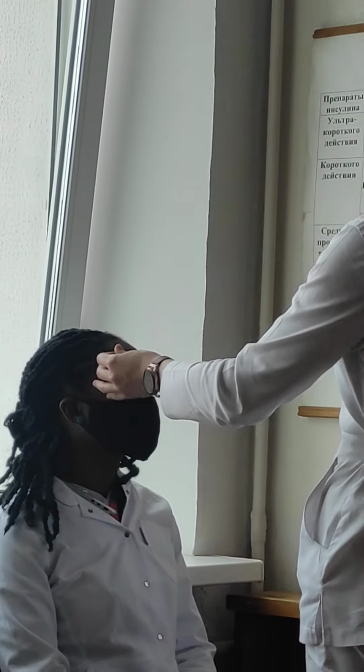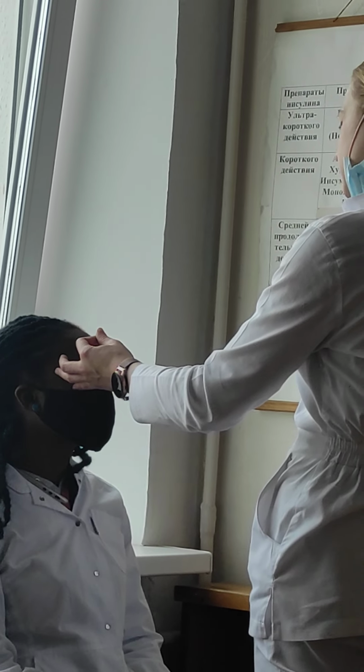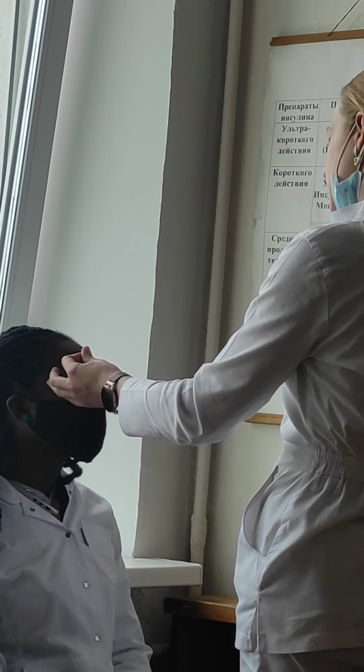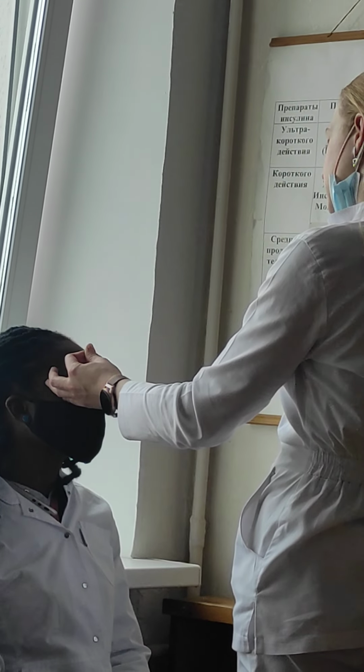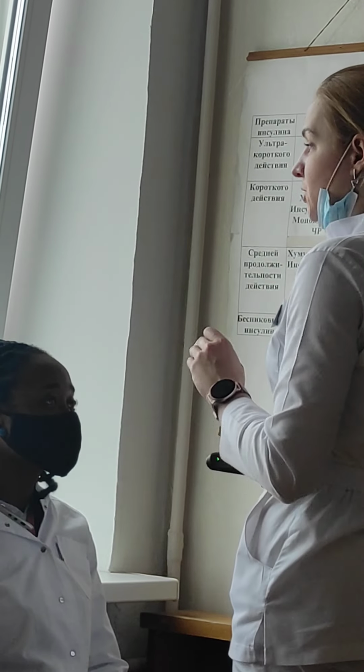After we see something, for example some vessels or the optic nerve, we observe this part, checking if there is any impairment or pathology at the place of the retina we can see. So first we check the optic nerve disc head.